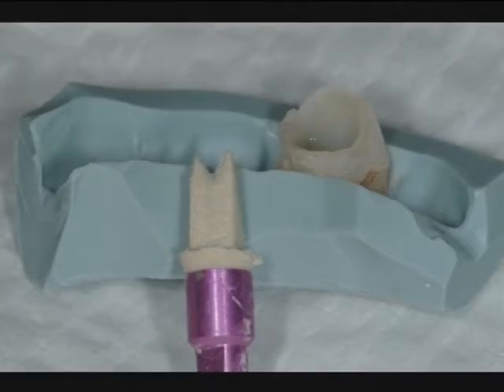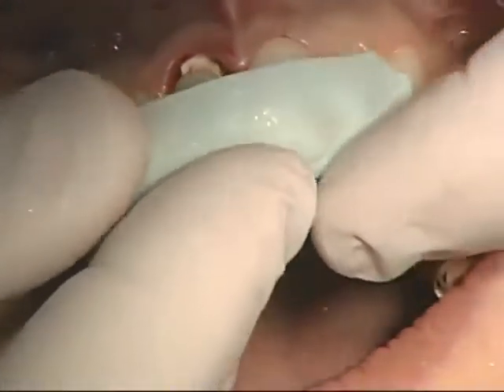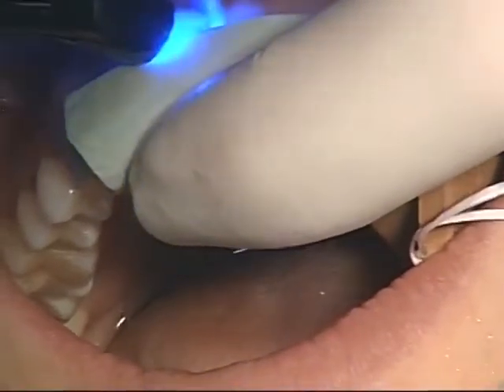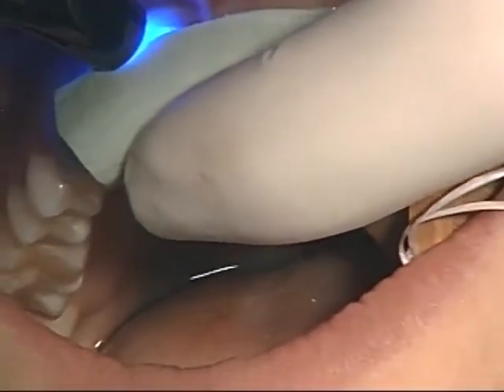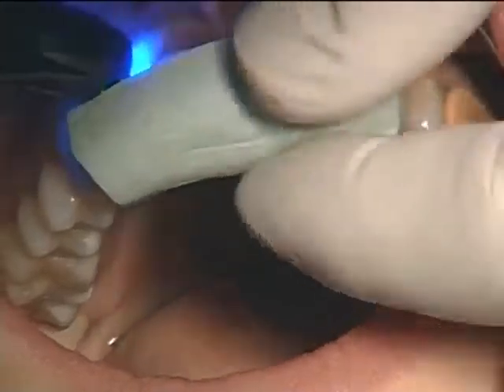An index placed, which was taken prior to tooth removal, which will align the contact points and emergence profile of the provisional up with the adjacent teeth. So prior to placement of this registration material, our temp stent is put into the incisal edge of that and then inserted into the mouth. Light curing to register the position of the temporary on the abutment itself, and you can see the initial light curing is then followed by a second light curing for further hardening of the composite material.